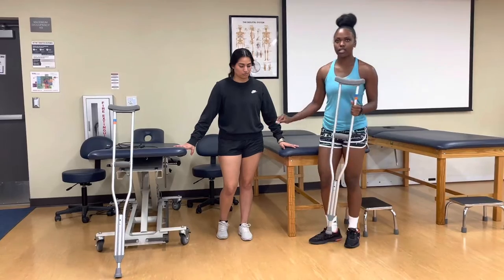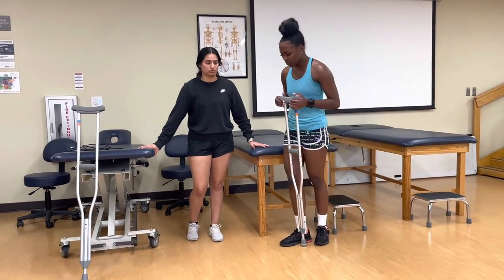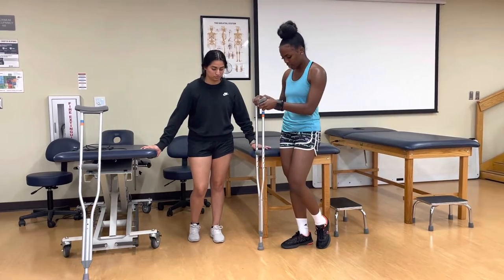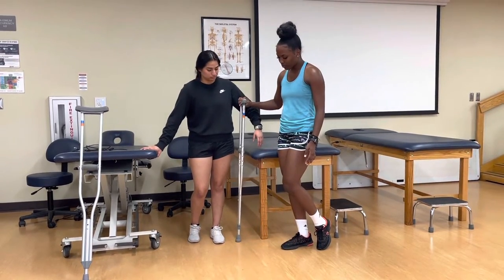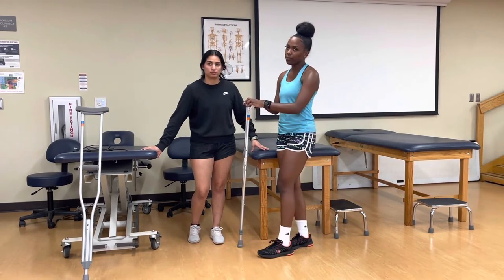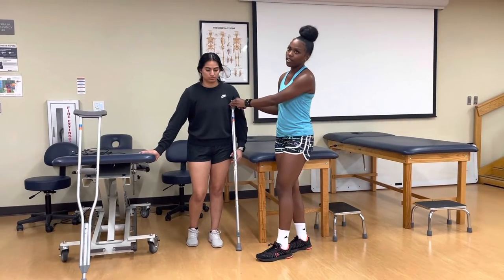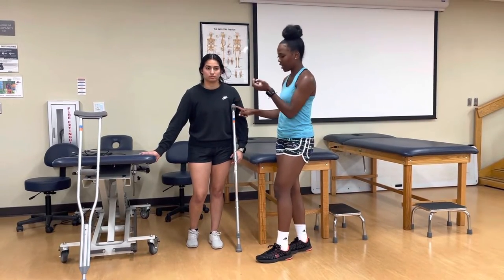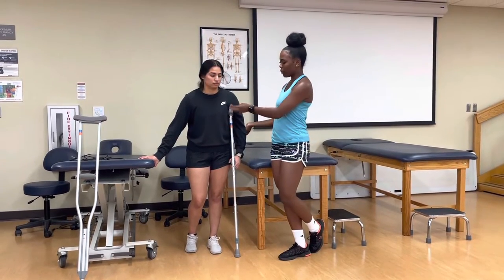You always want to fit or measure from the uninjured side. We want to start with the crutch tip, or the bottom of the crutch — six inches lateral and two inches anterior to the uninjured foot. Then it's going to lean under her axilla. Under the axilla pad, we want at least two to three finger widths below the armpit.